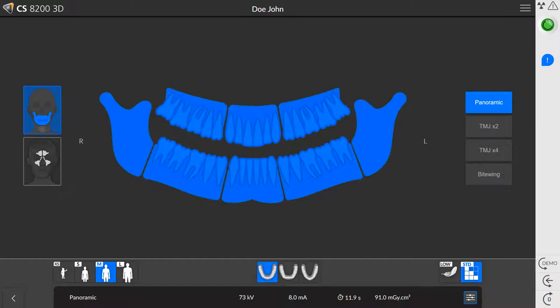Next, on the main interface, select the dental arch morphology or jaw shape. When you select the appropriate jaw shape, the trajectory beam is adjusted to capture the correct focal trough. U is for a normal jaw shape, and square or V are for a narrow arch shape.